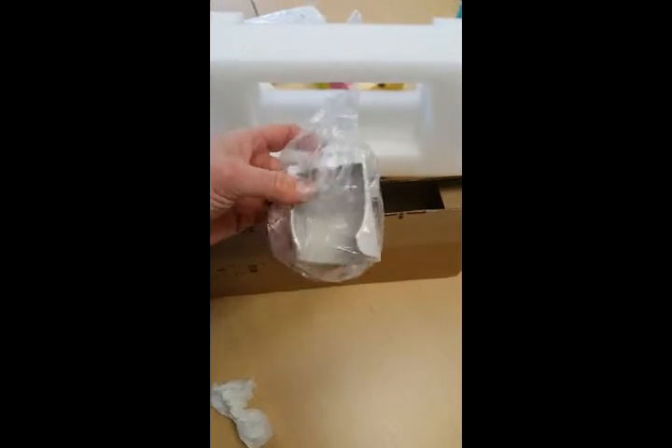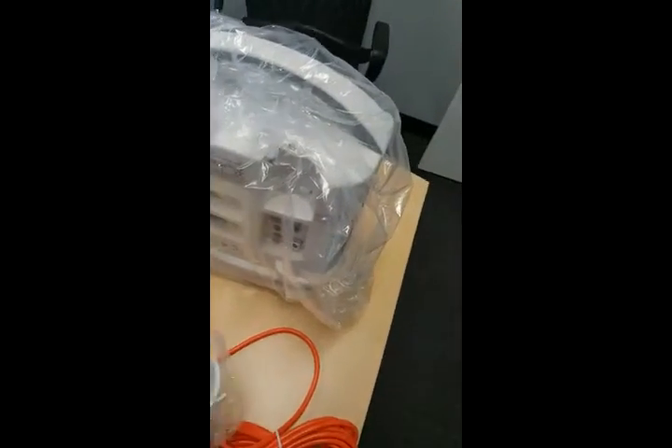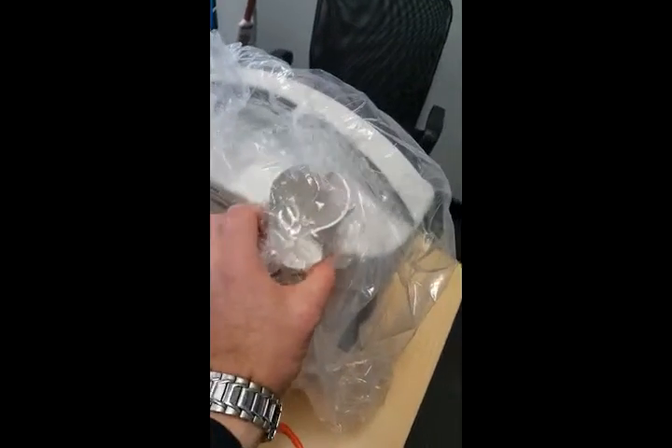This has got the cup thing here as well for the probe, and the cup thing attaches just on the back through here.